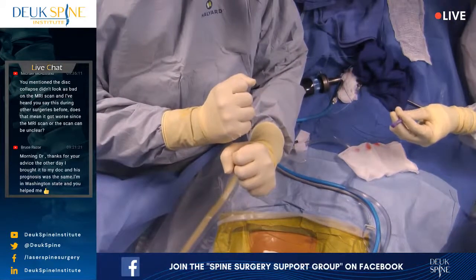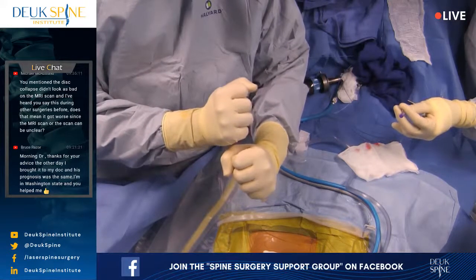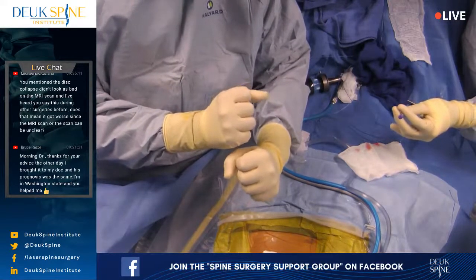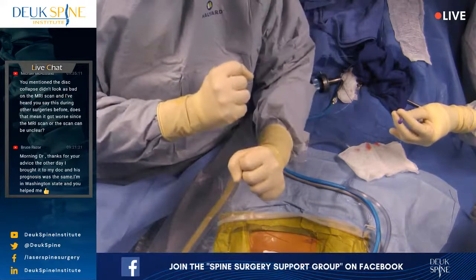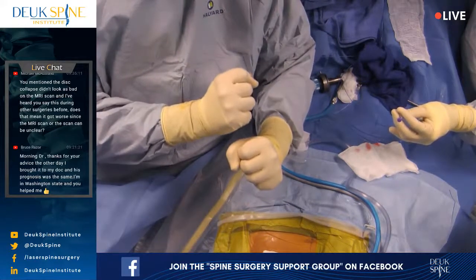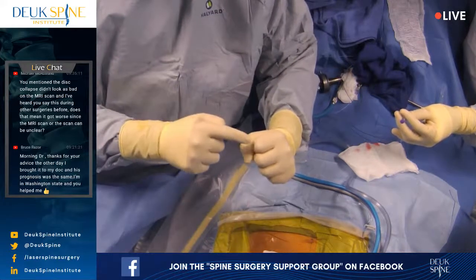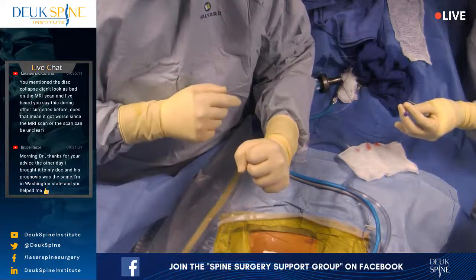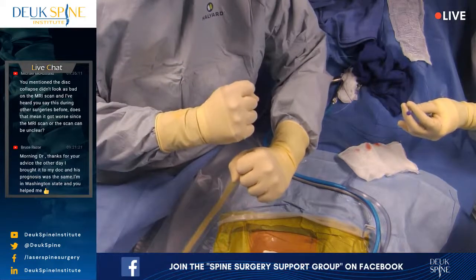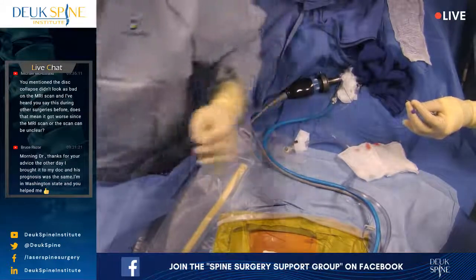Everyone sees models of the spine. They're perfectly lined up. If that was the way it was for every patient, this procedure would be easy. The problem is that the spine rotates, okay? It's called scoliosis. When you get a disc injury and the bones start to collapse, they actually rotate on each other. And when that happens, it changes the shape of the disc relative to your entry point and your destination point. So you have to take into consideration that rotation with the X-ray machine to try to line up the best path for the disc.